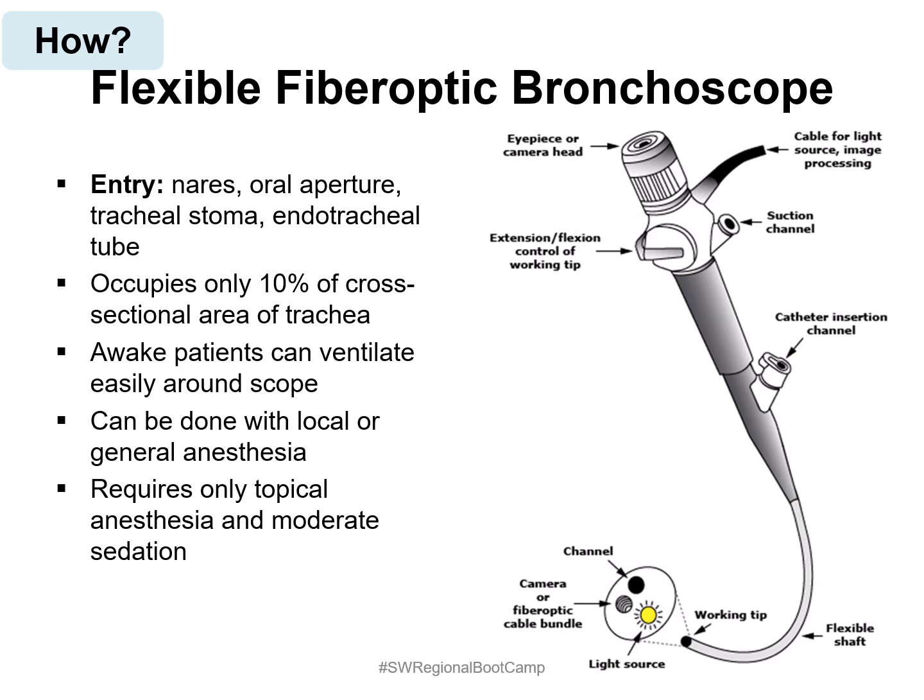There's also a suction channel as well as a catheter insertion channel, which is commonly referred to as a working channel. The distal portion of the scope is a flexible shaft which allows maneuverability within the airways. You can see a cross-sectional view of the tip with the working channel, camera, and light source. The typical length of the insertion tube is 600 millimeters with a diameter of 4 to 6.4 millimeters and a 120-degree field of view. The distal tip can angulate between 180 and 210 degrees. Working channel diameters will range from 1.7 to 3.2 millimeters.